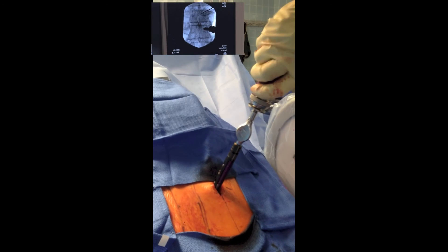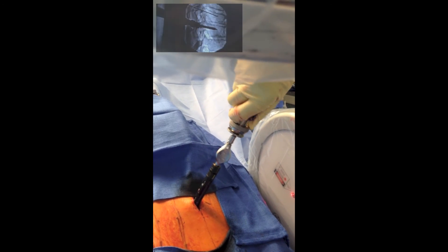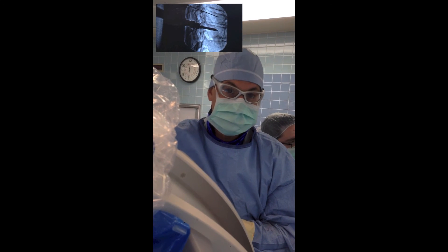No tapping, navigation, or electromyographic stimulation was performed. As you can see, this can be a very quick and efficient procedure that does not require a guidewire.